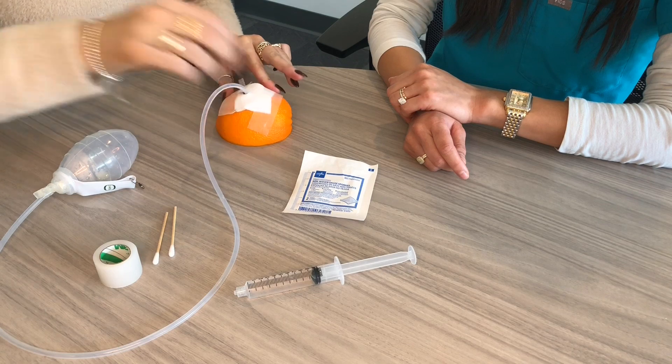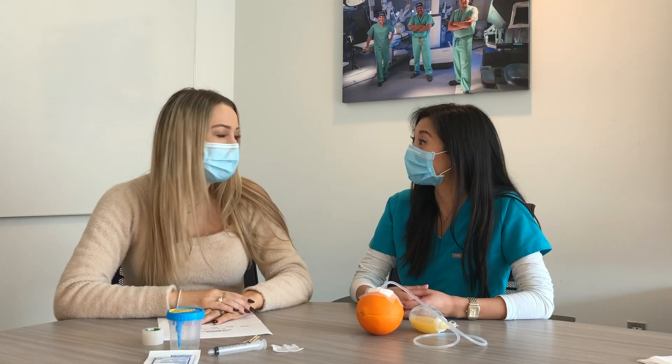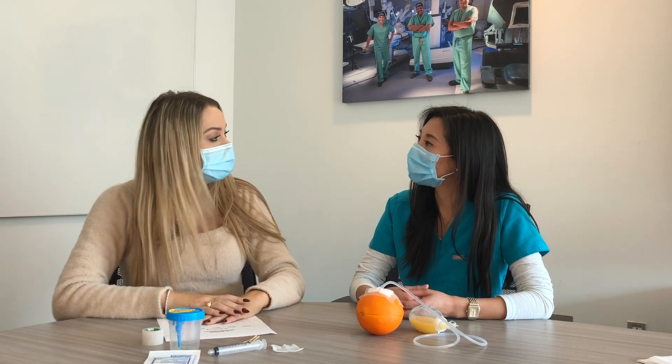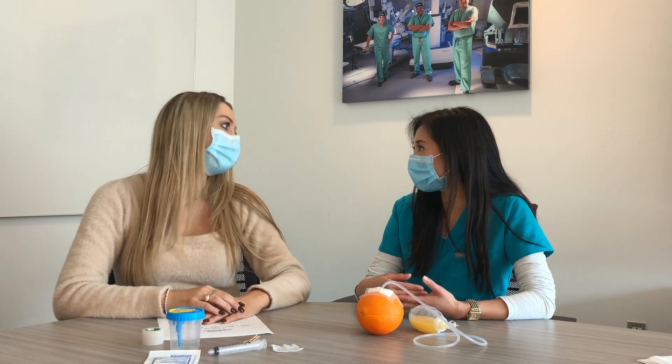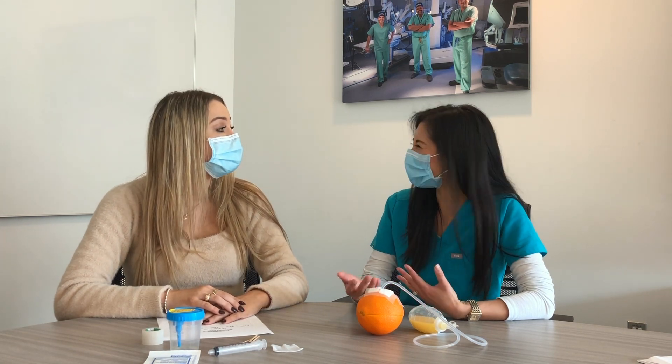Secure the gauze with tape, then wash your hands one last time. Your provider should tell you the specific times of day to perform drain care — if they don't, please ask. Starting the day after surgery, change the dressing every day or if it becomes soiled.